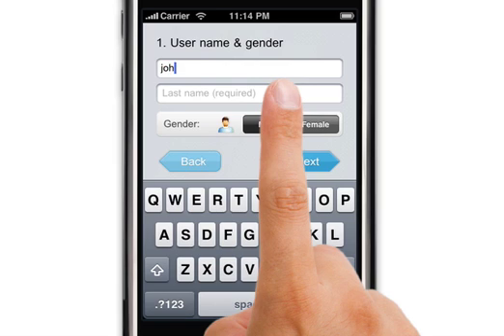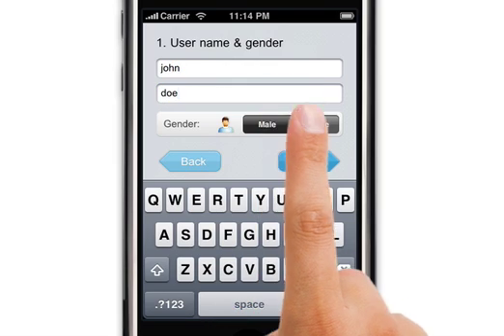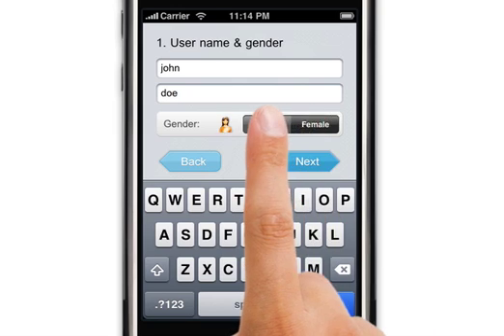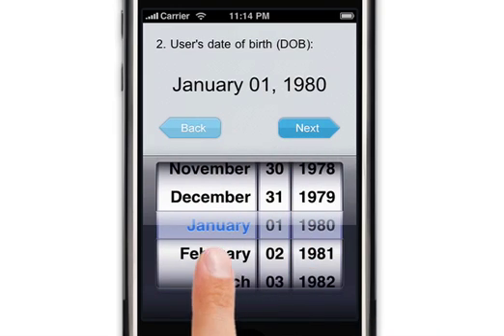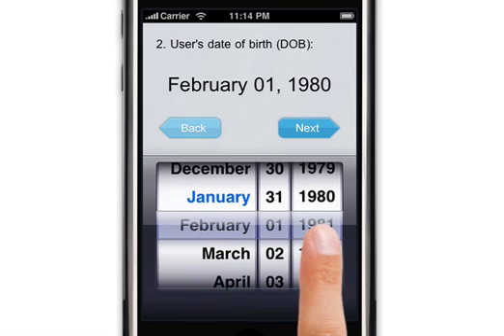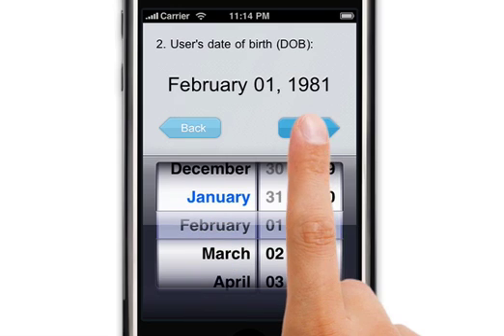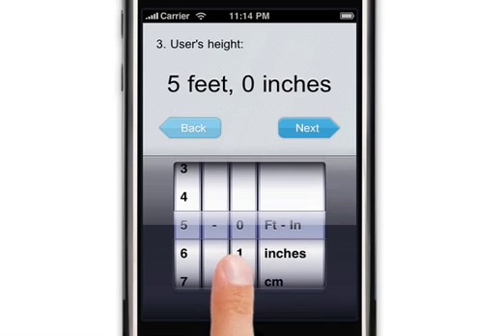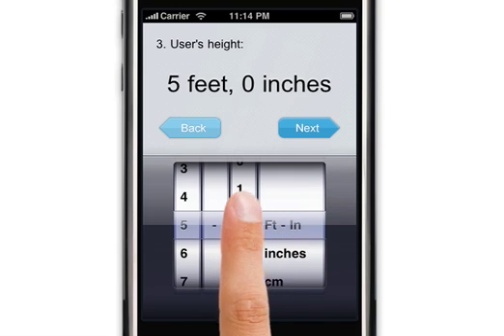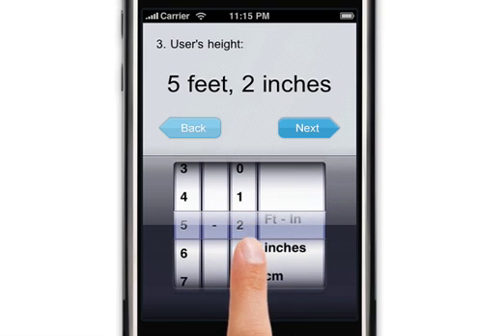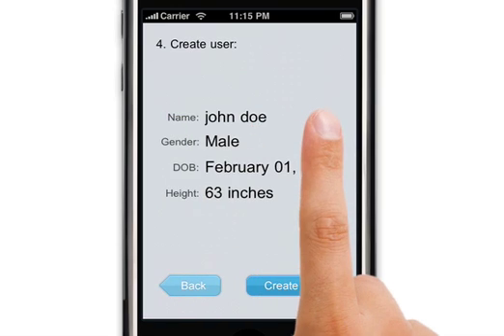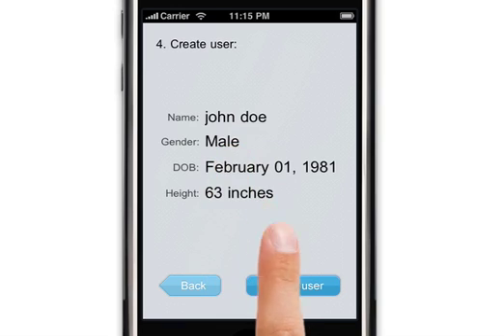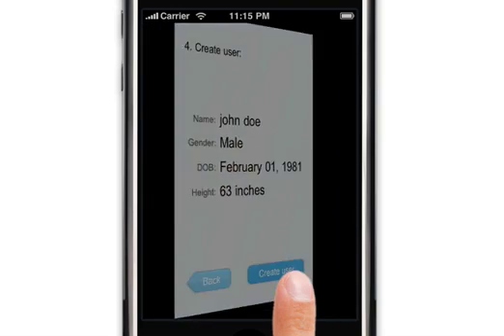When you open the AsthmaMD application for the first time, you will have to put some basic information for at least one user. Your personal information is secure and you have the option to use Password Protection later in the settings for added security. First, you enter a user's first name, then last name, gender, and date of birth. By entering this information, AsthmaMD is able to predict your lung volume.